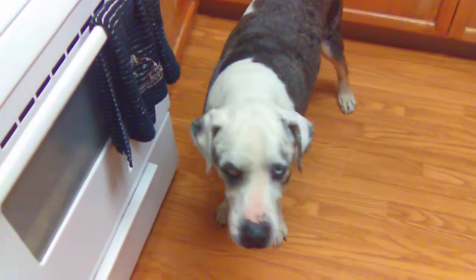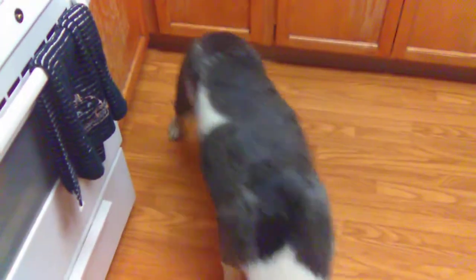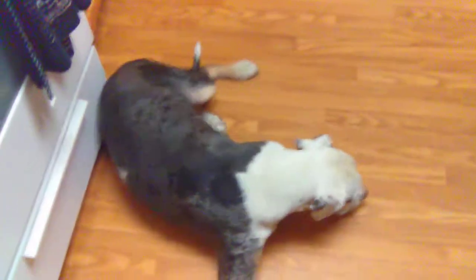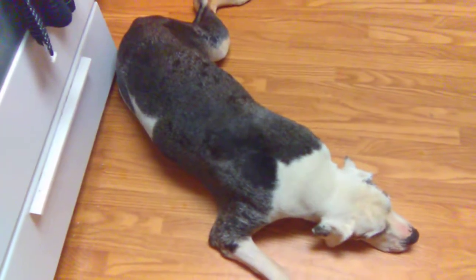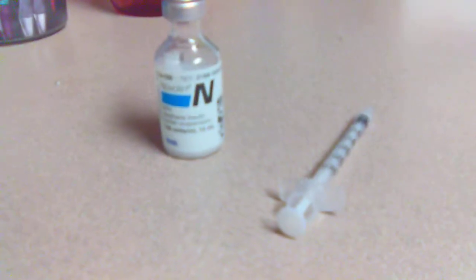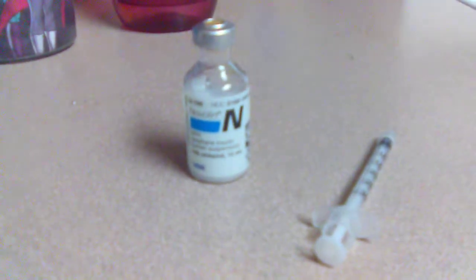We are about to give Roscoe his insulin shot. He just ate about a half an hour ago — with dogs with diabetes, you have to give him a shot. This is Novalin from Walmart. He takes 31 units right now, and this is a 30-unit needle, so I just go a little past the 30 mark.